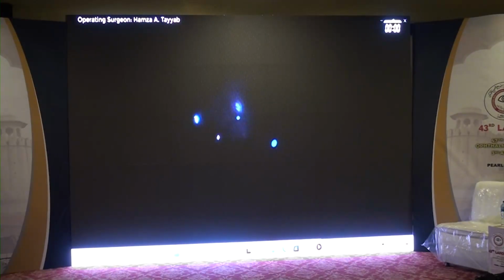All the margins are handled also with laser and dry. So there are multiple options. The safest way, which prevents the rolling back of the retina, is an exchange of heavy liquid and silicone oil.